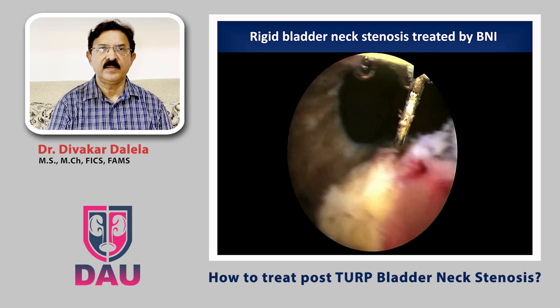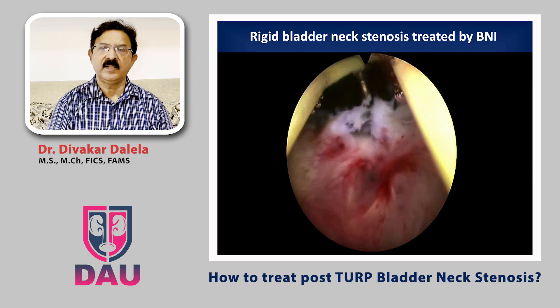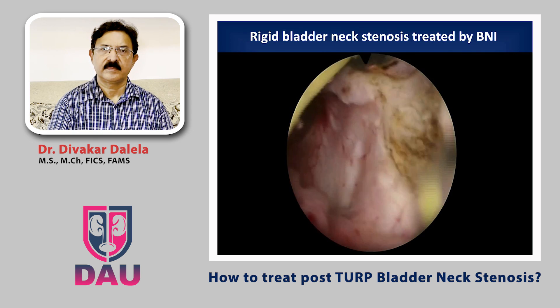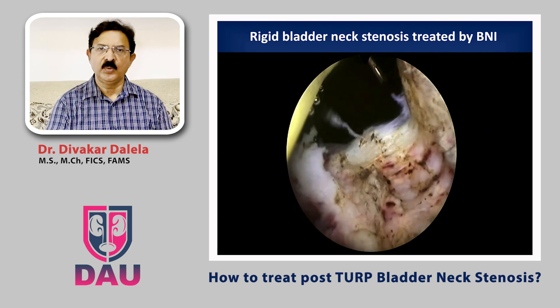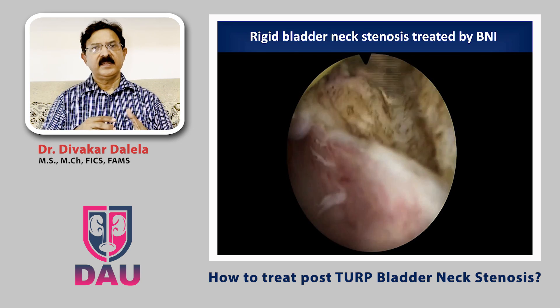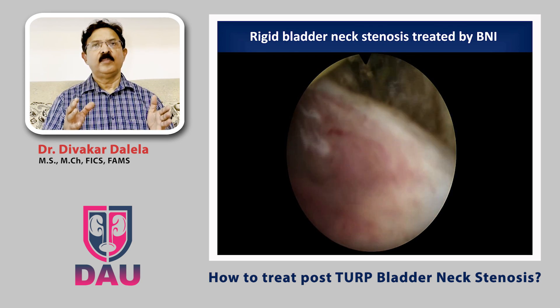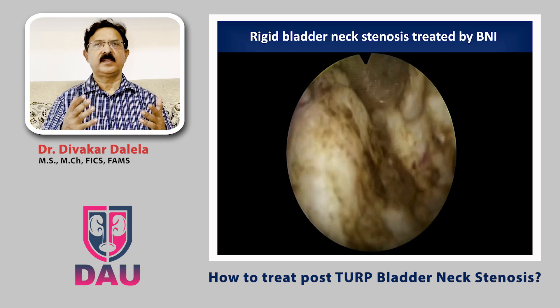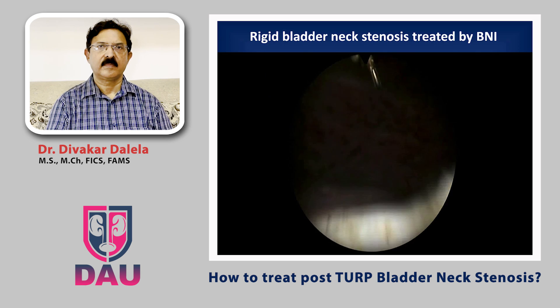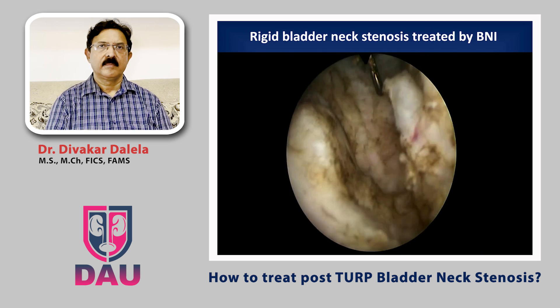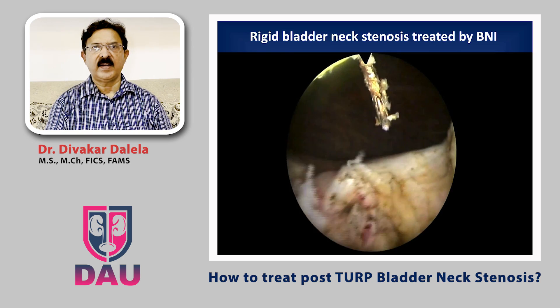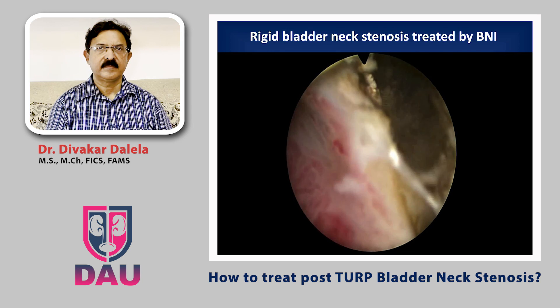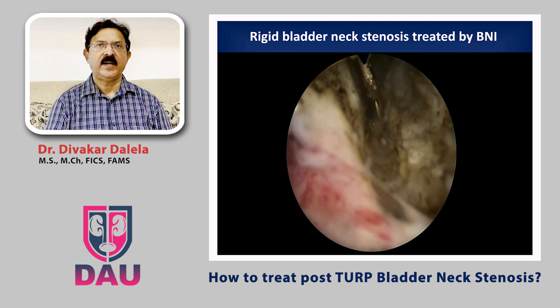Some people feel laser is more useful here, but I find Collins knives very quick and if you have the right setting of cutting currents it does not induce excessive fibrosis. You have to make deep incisions at the 7 o'clock location on one side, and having made that sufficiently deep, you move to the incision on the other side — a similar procedure is done at the 5 o'clock location. You are creating bilateral two trenches; the fibrotic ring is cut at two places and most patients do well after this operation. There is some recurrence rate but in my view it is fairly uncommon. This is the appearance of the bladder neck after bilateral bladder neck incision — bring the incision by the side of the verumontanum on both sides.